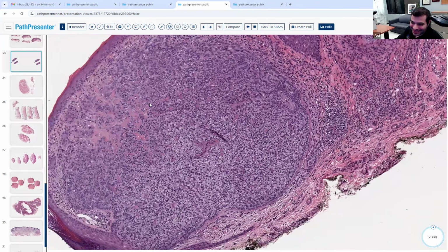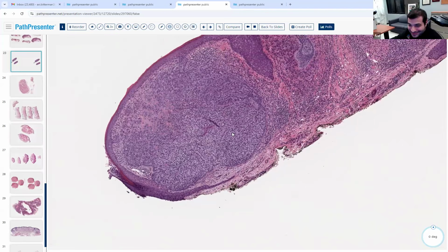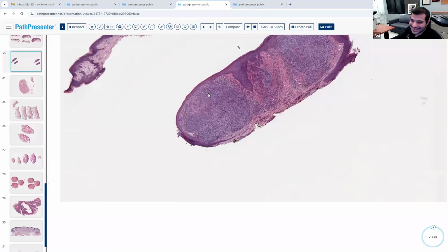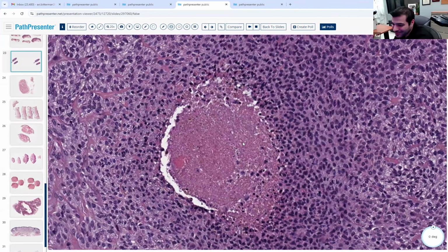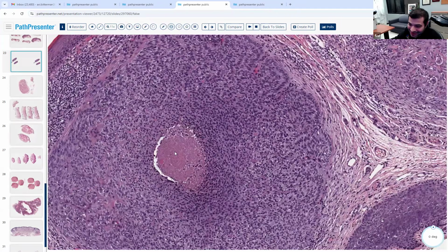Desmoplastic stroma in a trichilemmoma. You guys are getting good at this. What is it? Desmoplastic trichilemmoma. Yeah. Now, in this case, also, as Shane pointed out, there was an area of necrosis en masse over here. So don't jump the gun and say, oh, if there's necrosis en masse, it must be cancer. Because there are certain benign tumors that can also have necrosis en masse.